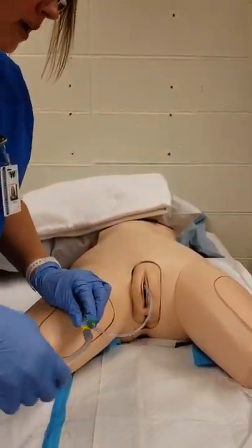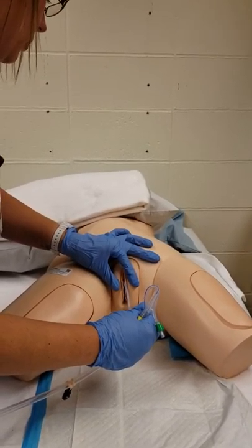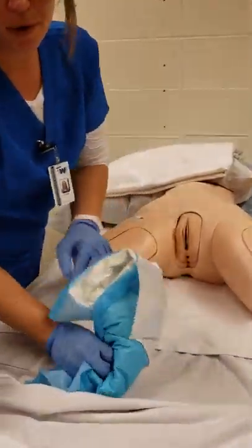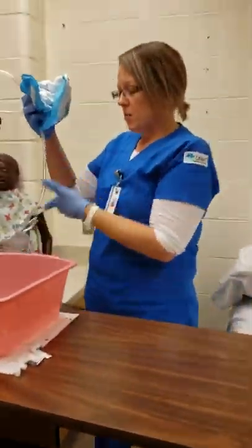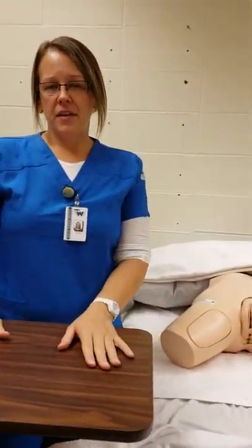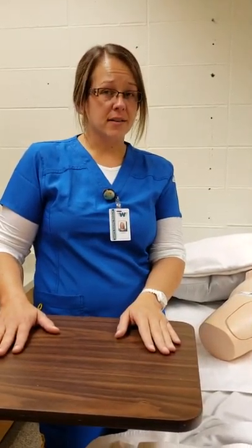Making sure I have everything positioned properly, I say: 'Shirley, on the count of three, take a deep breath and I'm going to pull it out. One, two, three.' I immediately fold up the catheter, remove it, bring the entire assembly and drainage bag down, and dispose of everything in the biohazard bag. I take off my gloves and document the procedure.